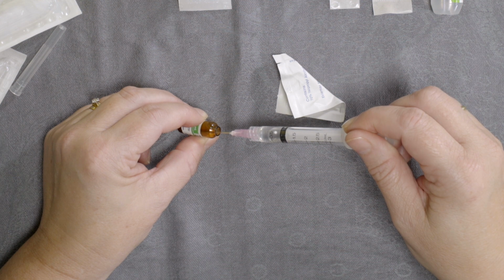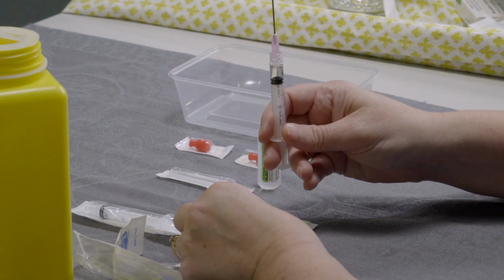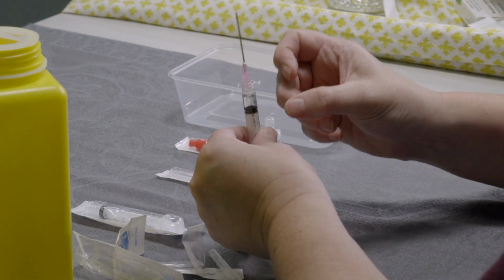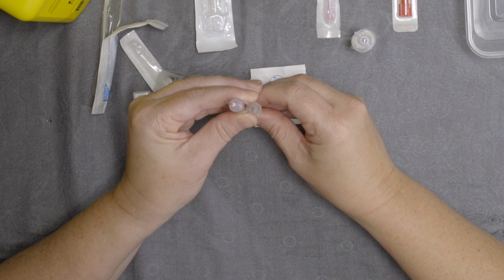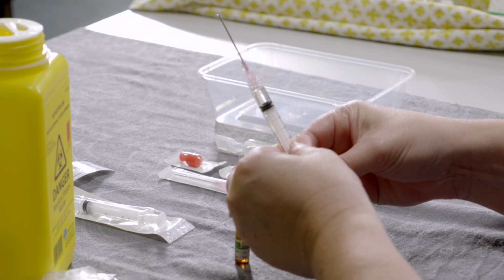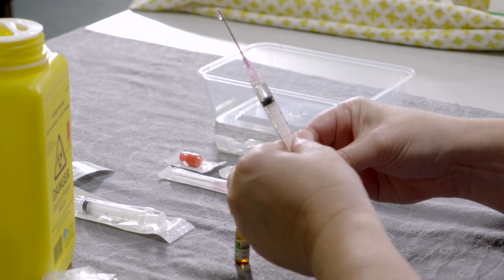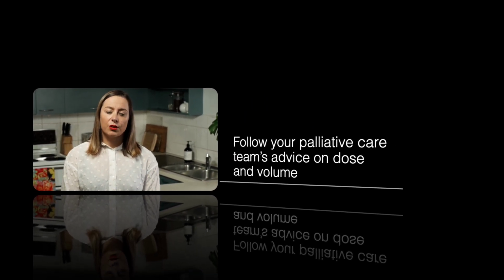When the fluid is in the syringe, make sure it is held with the needle pointing to the ceiling. Remove any air bubbles by flicking the side of the syringe with your finger. This will push the air bubbles to the top. Then gently push the plunger until the air is gone and the fluid is at the required level for the dose to be given. Your palliative care team will advise you on the dose and volume ordered, and whether you need to draw up more than one dose out of the same ampule using another syringe. Follow your palliative care team's advice on dose and volume.